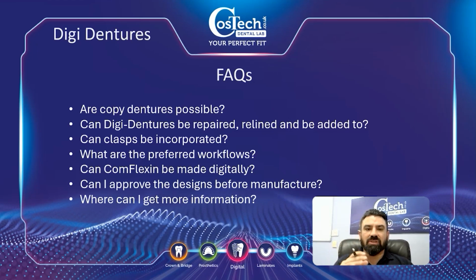If the patient says, oh, I want to try it for the final thing, if they definitely want to go down that route, you have to go down the traditional route. But if they're okay with just visually saying, okay, yep, I'm happy with the way those teeth look.